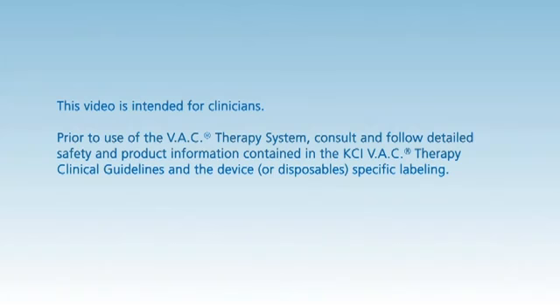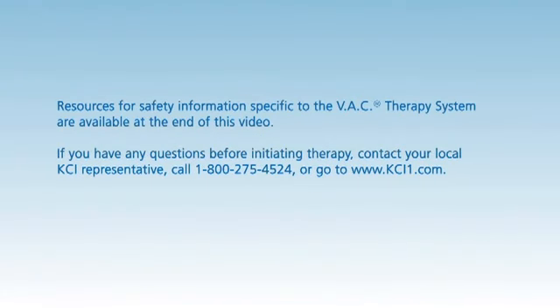Prior to use of the V.A.C therapy system, consult and follow detailed safety and product information contained in the KCI V.A.C therapy clinical guidelines and the device or disposables specific labeling. Resources for safety information specific to the V.A.C therapy system are available at the end of this video. If you have any questions before initiating therapy, contact your local KCI representative.